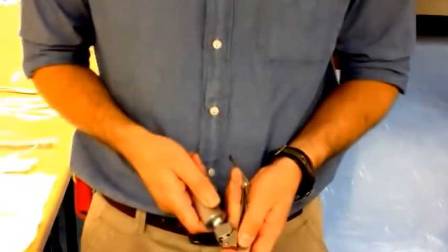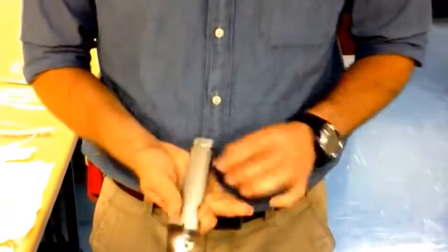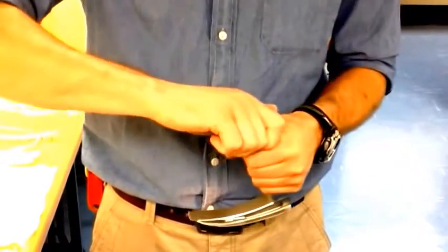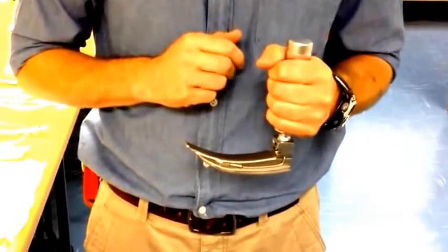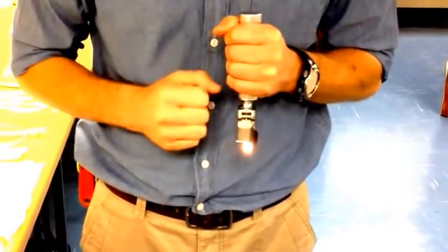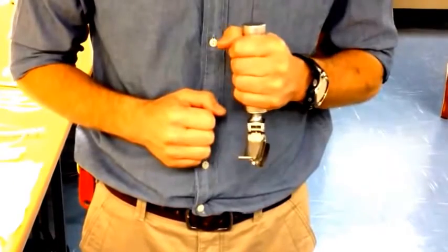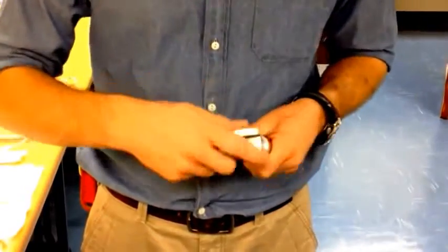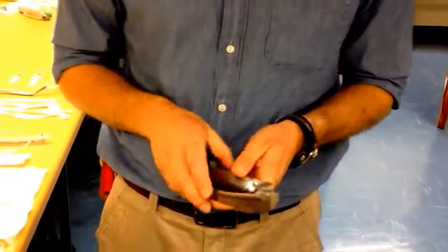Take your laryngoscope and blade and assemble it in the correct manner. Ensure that it works in the position of use which is upside down. The butt cap should be firmly attached and there should be no battery play inside. The light should be functioning even when the blade is stressed. Make sure that there's no jiggle or free play in the blade and ensure that the bulb itself is tightly screwed in and not jiggling about. Your laryngoscope is now checked and ready for use.